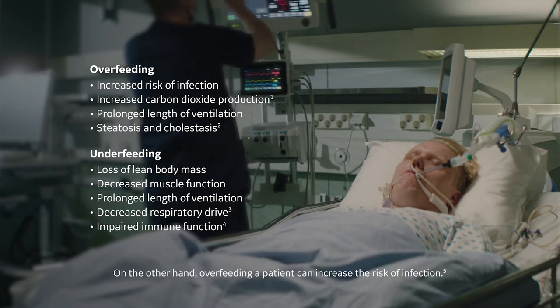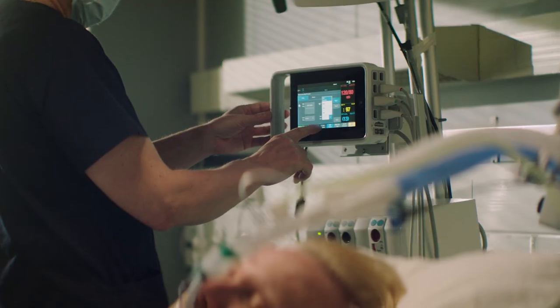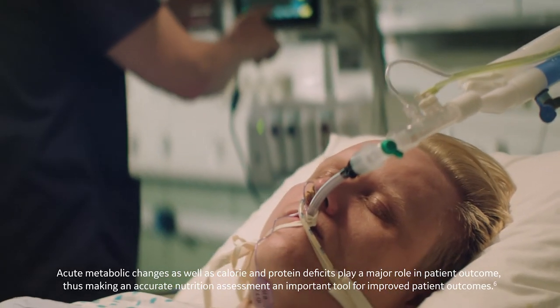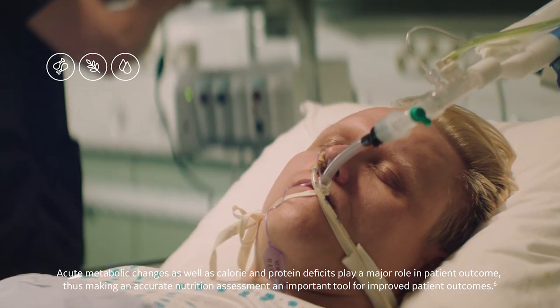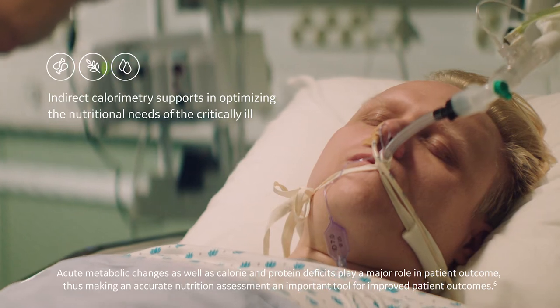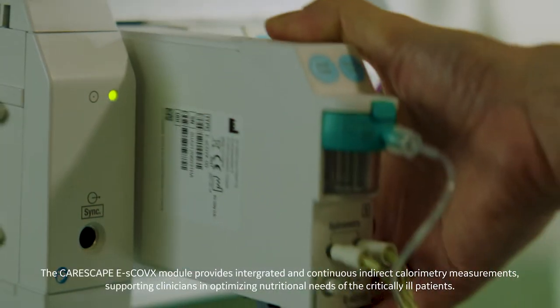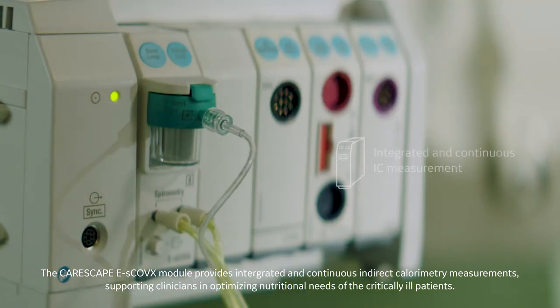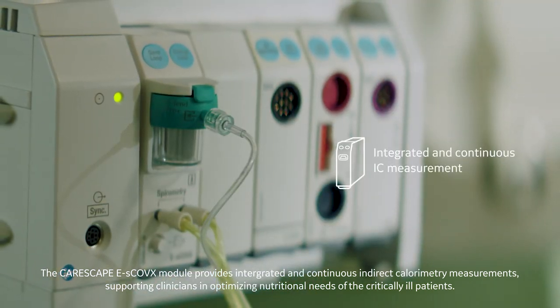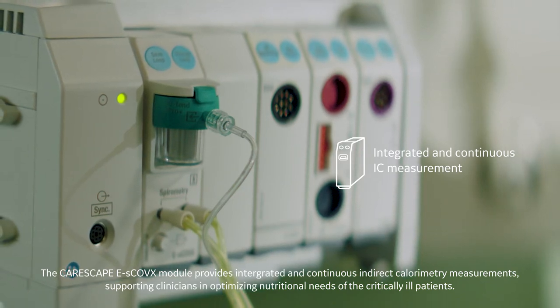On the other hand, overfeeding a patient can increase the risk of infection. Acute metabolic changes as well as calorie and protein deficits play a major role in patient outcome, thus making accurate nutritional assessment an important tool for improved patient outcomes. The CareScape ESCOVX module provides integrated and continuous indirect calorimetry measurements, supporting clinicians in optimizing nutritional needs of the critically ill patients.